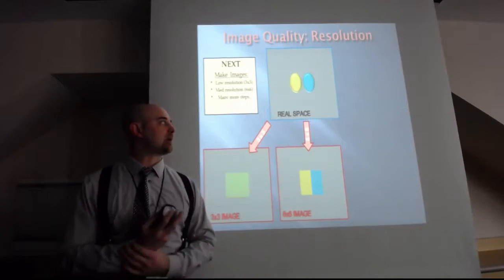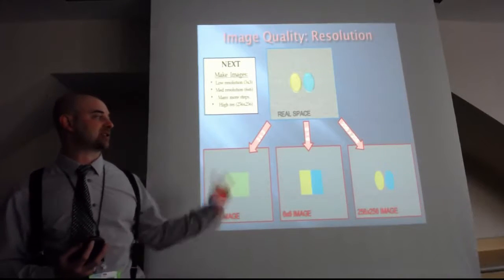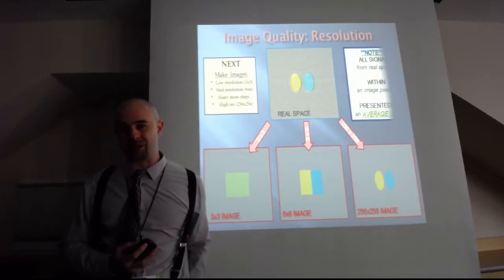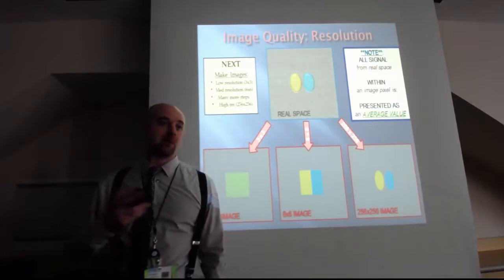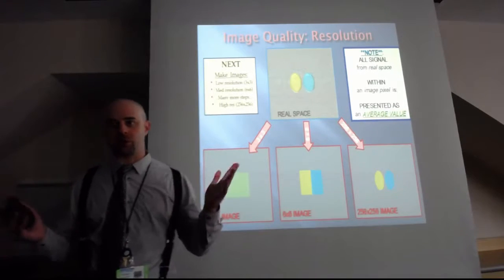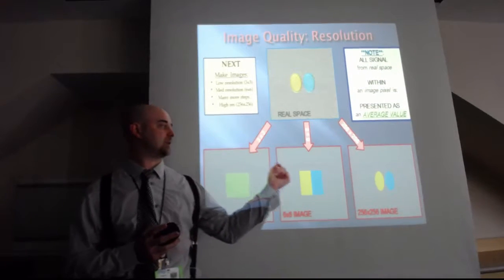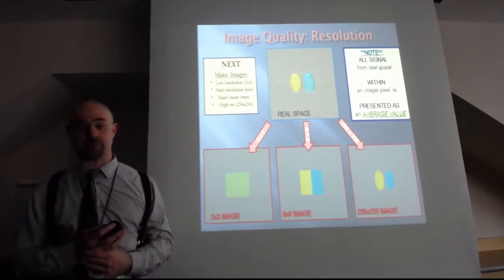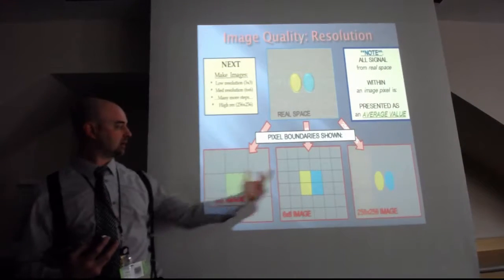Right. So if we then continue to increase over many steps, and we say make a 256 by 256 matrix, we get this imaging representation, which now is maybe flattened, and we don't expect to have perfect exact replication of real space, but we're seeing there's a yellow oval and a blue oval, certainly much closer than we were before, looking at our pixels here.